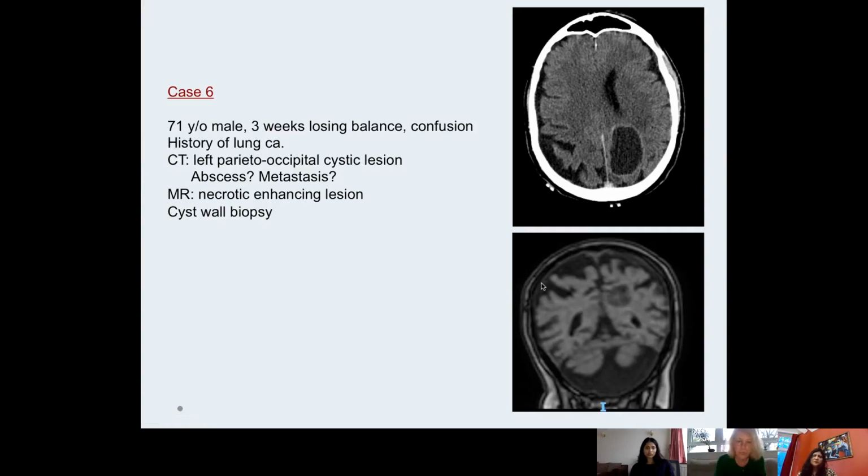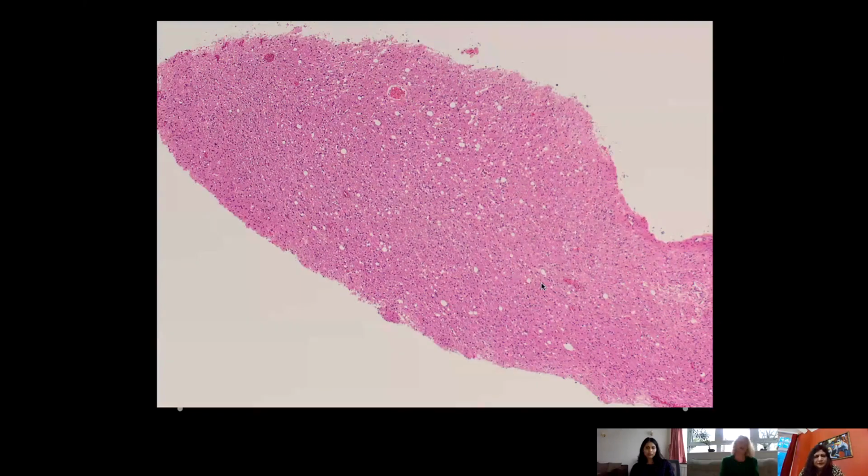And so this is the biopsy. It's essentially everything that we receive. Here at the bottom right, I couldn't take the image of the whole tissue. There was a bit of cortex out here, but it was essentially normal cortex.